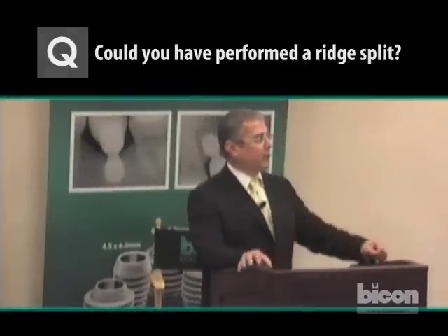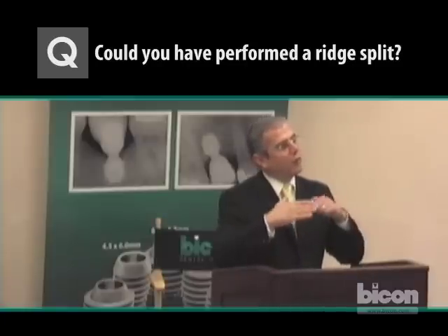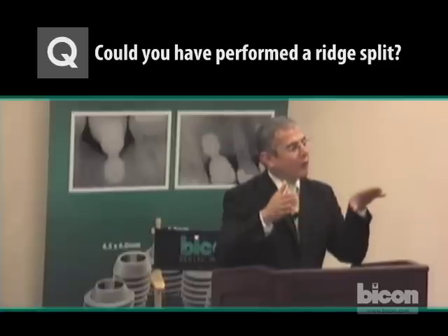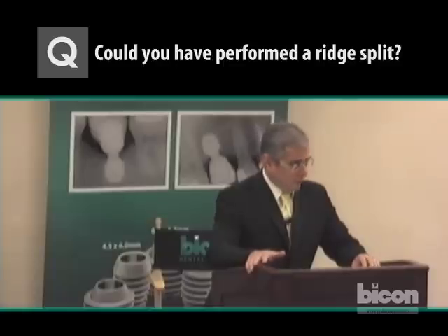We could consider a ridge splitting for the first case. The span mesiodistally is very tight. The other limitation is the curvature of the bone — it comes up to a very thick root in the canine and another in the bicuspid. And by the time we get to adequate width, we are in the sinus. So it would have had to be a combination of a ridge split and possibly a sinus lift, which would have been technically much more difficult than the actual graft.